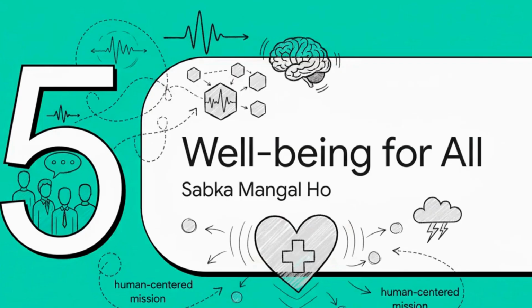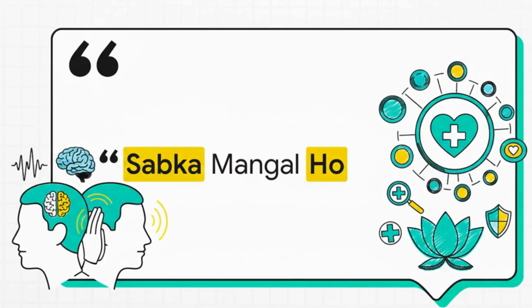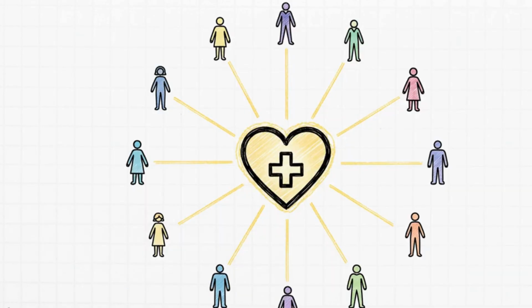So you've got this amazing technology, the multimodal analysis, the real-time conversation in any language, but it's all in service of a single, deeply human mission. The mission statement for this entire project is a simple Hindi phrase, Sabka Mangal Ho. And what that translates to is well-being for all. See, this isn't just about building technology for technology's sake. This is about building technology with a soul. The whole purpose is to democratize healthcare, to make sure that everyone, it doesn't matter where you live or what language you speak, has access to the tools they need for a healthier life.